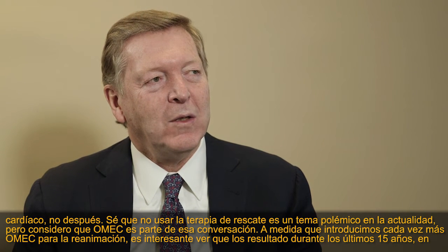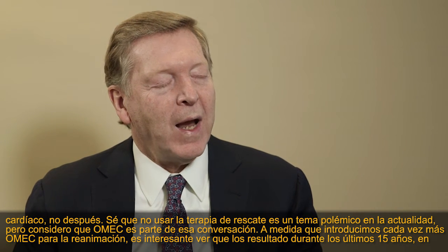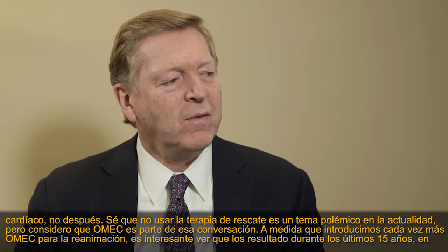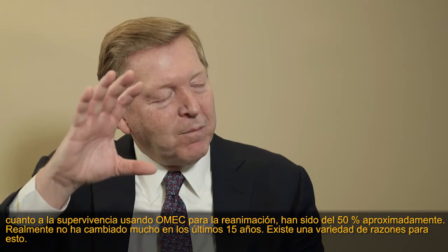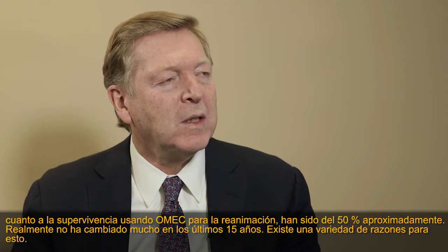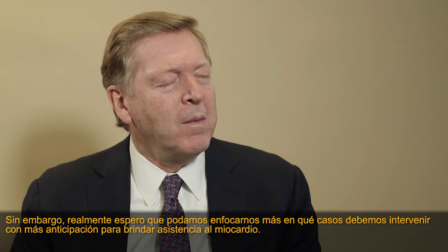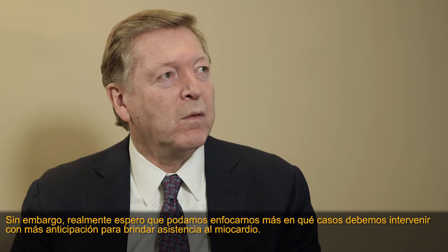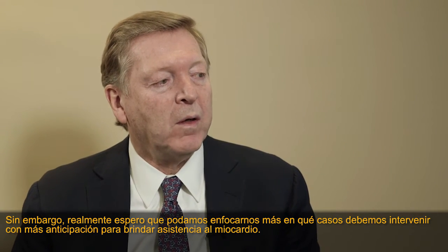If we introduce ECMO more and more for resuscitation, it's interesting to see that the outcomes over the last 15 years in terms of survival using ECMO for resuscitation have been about 50%. And it really hasn't changed very much in the last 15 years. And there are a variety of reasons for that. But I really hope that we can focus more on when to intervene earlier to support the myocardium.